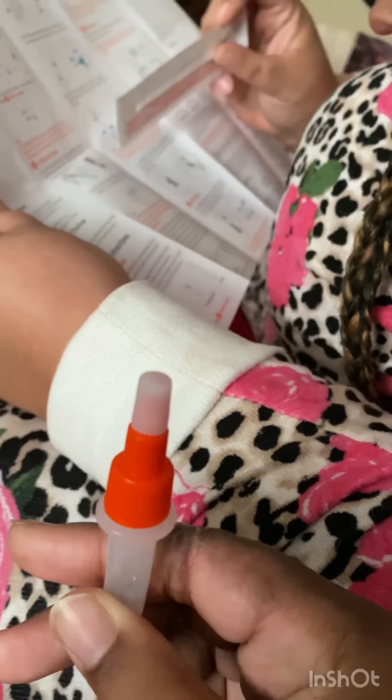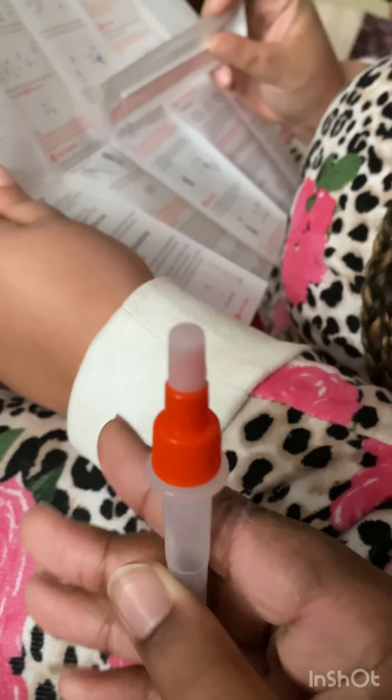Okay, time to collect the sample. Please don't dig all the way into my brain. One, two, three — come back here. I gotta do it two more times. You don't go all the way up with that. I did go all the way up. Come on, don't — oh yeah, I got two more times to go in that nostril. One, two — I didn't even go all the way up. Come back.